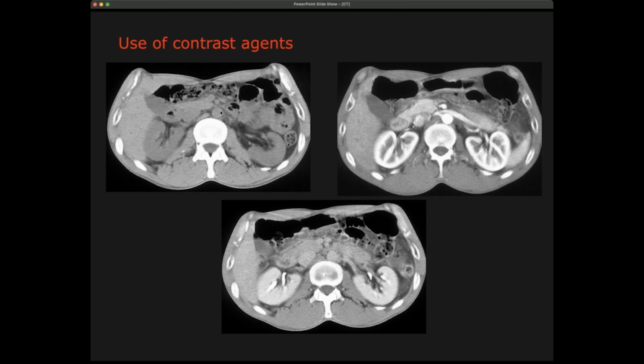One of the things that you also see is, for example, this structure here, a circular structure very close to the spine. When it is this ideally circular, it can be a nodule, but otherwise, in a normal body, you don't have a lot of ideally circular structures, except blood vessels, of course. Blood vessels have a circular cross-section.